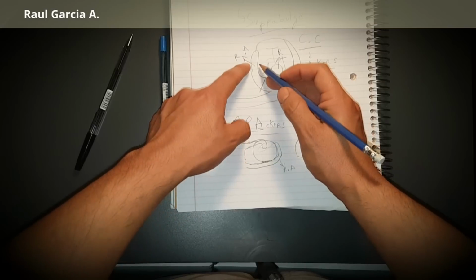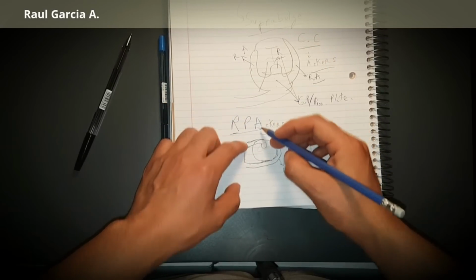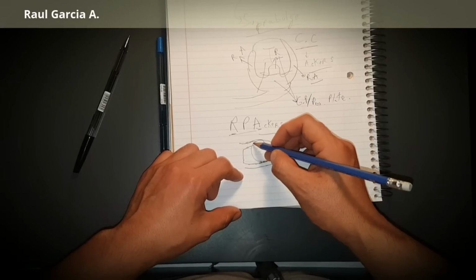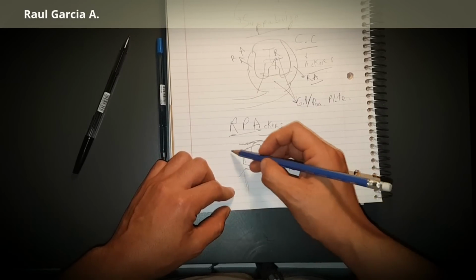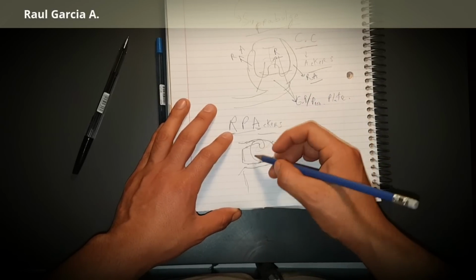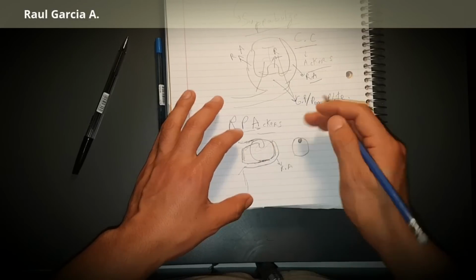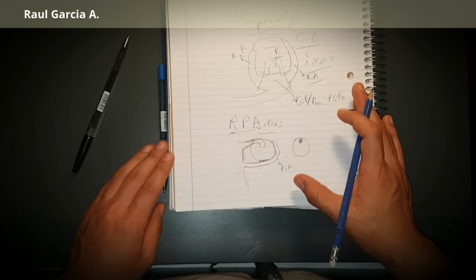And the difference is that we will not have a reciprocal arm here. You just have the distal guiding plane here, and then the minor connector, and it comes here from the rest of the structure that you're doing here. And that's the retentive arm. So all of this will play like the reciprocal arm, the minor connector, and this portion here. So that's the RPA design.